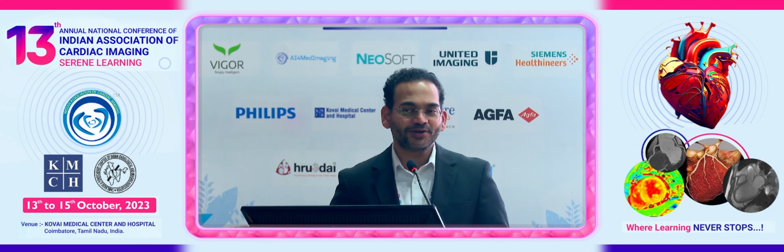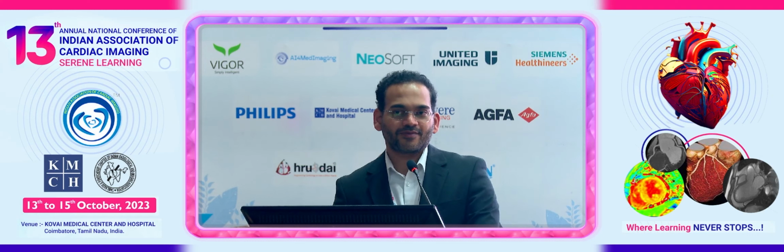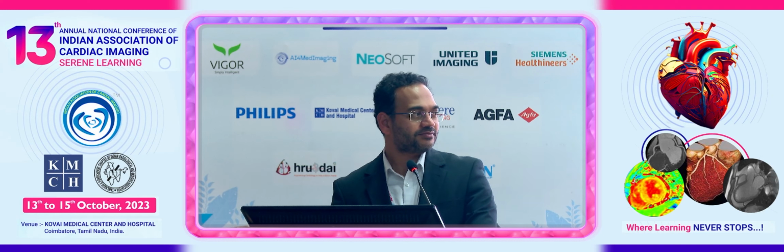Absolutely. I've had a patient who went into the OT, and they said, okay, this patient is not for TAVR. We take him to the OT. When they opened, they realized that the whole aorta was in a bad shape just because nobody ever read it. You've got aortoarteritis all along, and there's no chance that this patient really can be operated. So I think there's a lot of things that can be looked at.